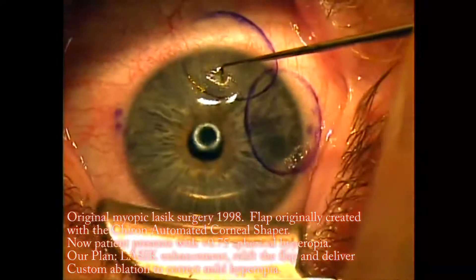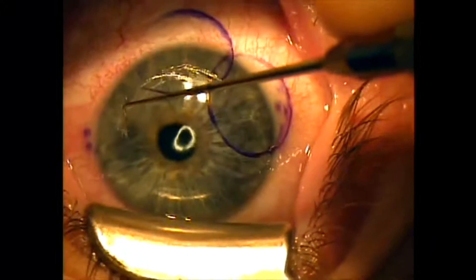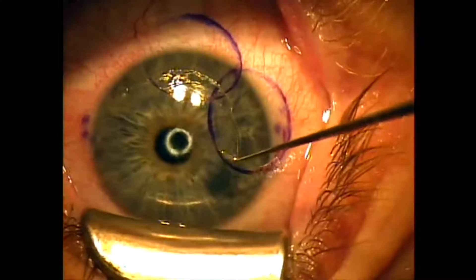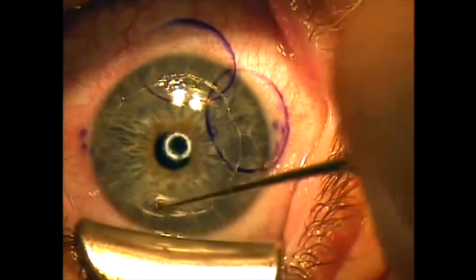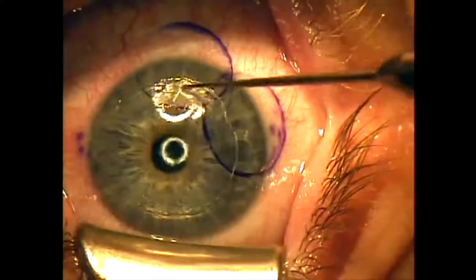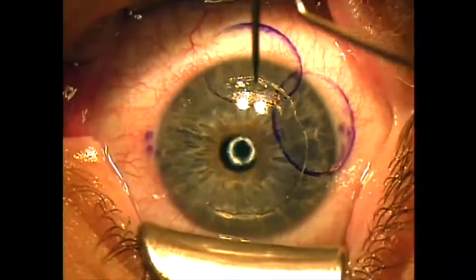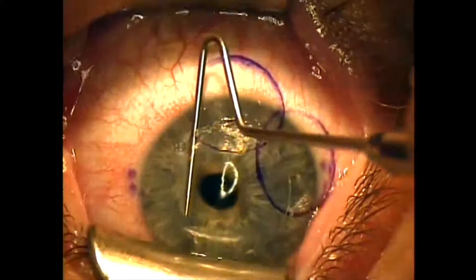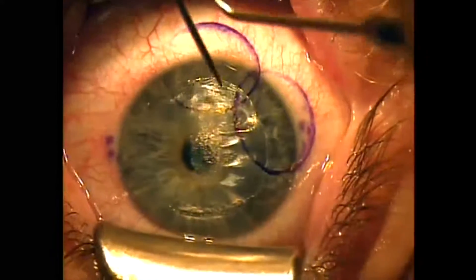We use a SIBL flap lifter to separate the adhesions at the flap edge. We can, underneath the microscope, very easily see the flap edge and then just separate the periphery and then re-lift the flap to deliver our excimer ablation. I have found that there's no flap that cannot be re-lifted, so this flap is being re-lifted 13 years after it was created — it's now June of 2011. The flap looks even with the exception of a little indentation there at 2 o'clock, which is well outside the visual axis.